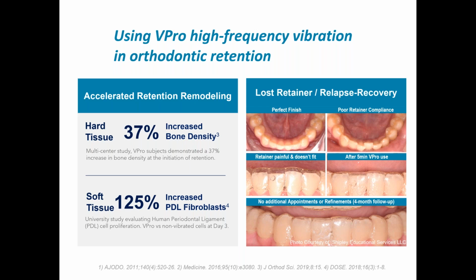Along with the VPRO, you will get that catabolic effect, where you need to soften up the bone again and get the inflammation increased, and that will get those teeth moved and the aligner seated again. So you can save some cases where a patient was not compliant with the retention and you want to be a nice doc out there, you can do that. Okay.